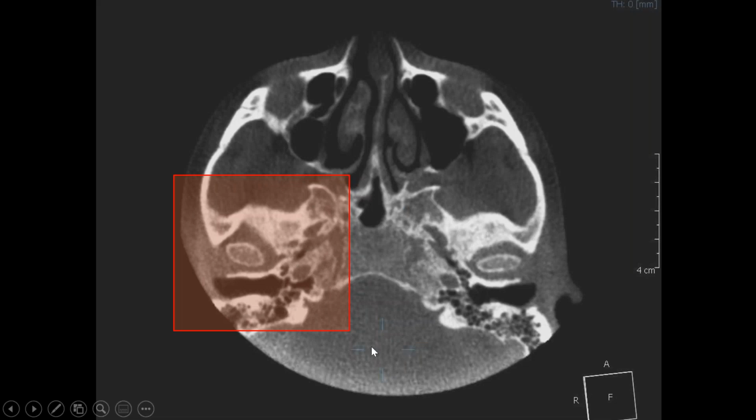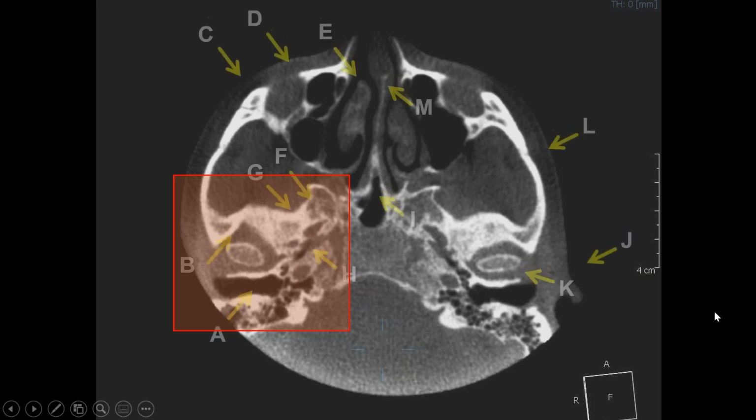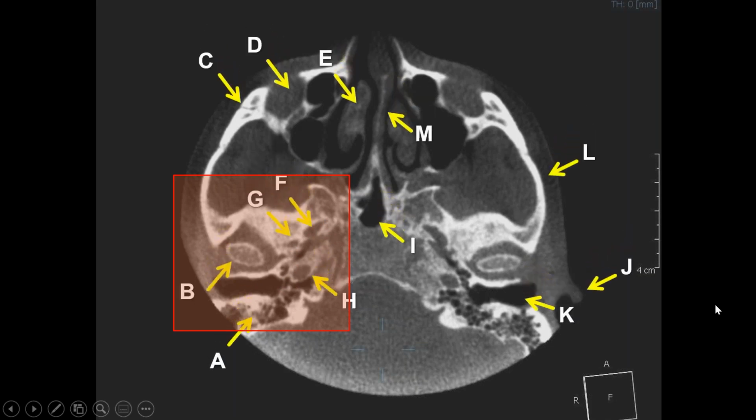So this is a schematic that I put in here. I showed you this image earlier, but this is the typical 4x4 image, 4x4 centimeters. Some people say, I only do the temporomandibular joint, I'm an expert in that. They need to really understand all the anatomy around it and look at the important structures. Ovale, spinosum, carotid canal, all the ossicles within here. The eustachian tube is there as well. So I'm not going to go over those again.